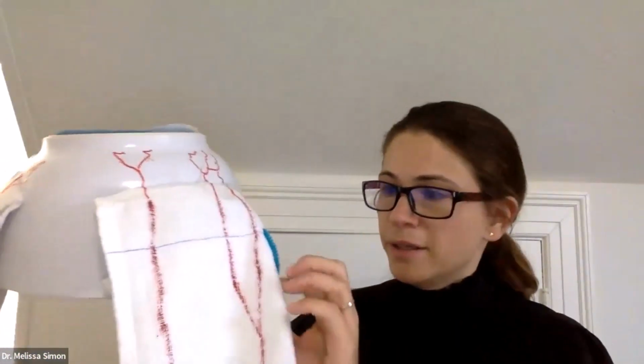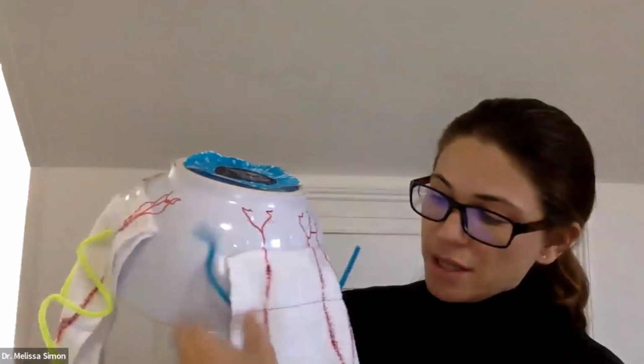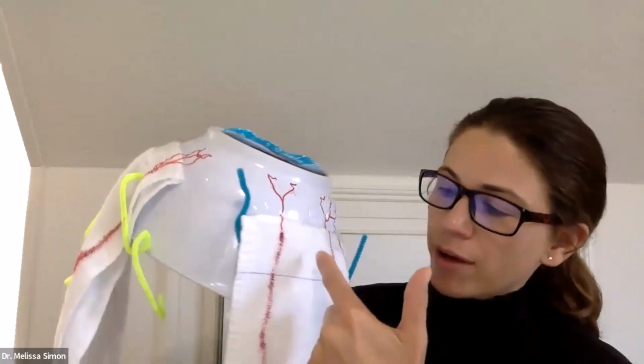So can I please repeat the steps of suturing for plication? Yeah, so this is my little model here. I don't know if you mean suturing the muscle or suturing the sclera, but in the Ken Wright technique, the first one I showed you, you do your partial thickness, center to edge, and then a locking bite, avoiding the vessels. And then you do the same thing on the other side, partial thickness and a locking bite, avoiding the vessels. For the Monte del Monte technique, which I like, it's new to me, but I thought it was really great and the outcome was great.